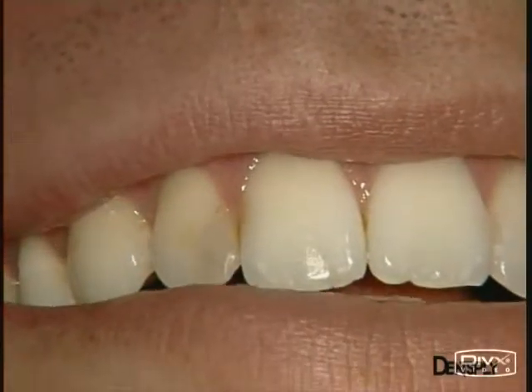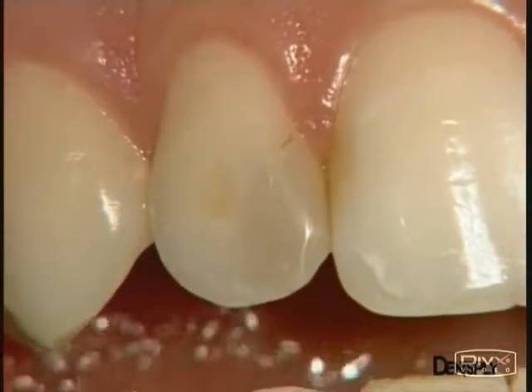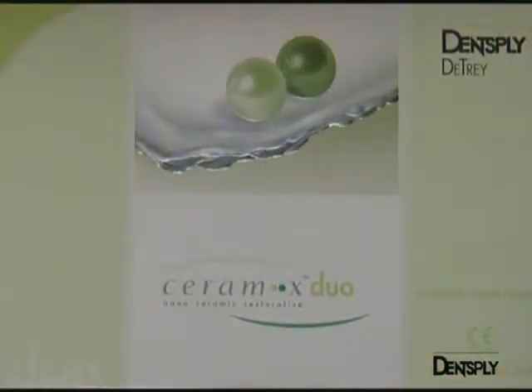In this clinical case, there is a large restoration to be carried out on the lateral incisor. You can see that there is an old composite filling to be changed. A material with different opacities has been chosen: Ceram-X Duo Nano Ceramic Restorative from Dentsply.